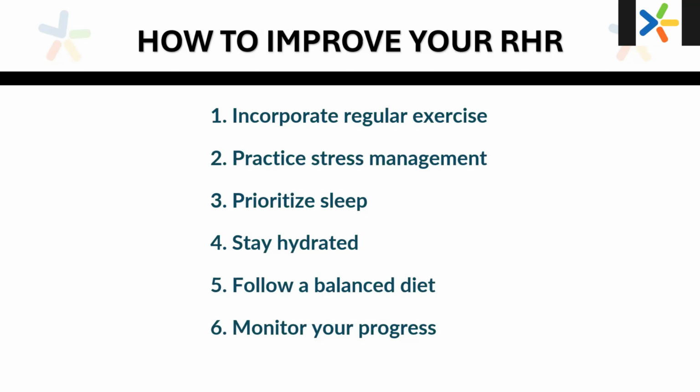And sixth, monitor your progress. And this last one is very important because when you scan somebody, and I'll go over identifying patterns later on, the more and more you scan people, you'll be able to determine if something is a pattern, meaning their resting heart rate is outside of the average consistently, or maybe during that one scan, it was just an off week or an off day, which is okay. So that's why it's so important to do follow-up scans on people on a consistent basis, so that way you'll be able to identify patterns.